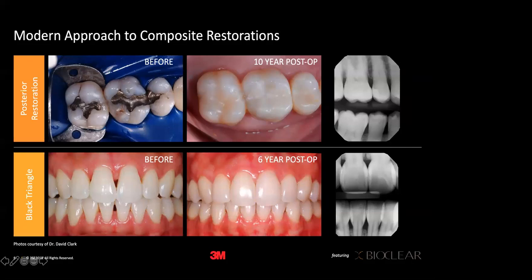One of the things that I think is the most interesting when you look at this is the beautiful radiographic appearance of the Bioclear method. It looks very different than anything we've ever seen before. It's as if the composite and the tooth are one entity, one person.